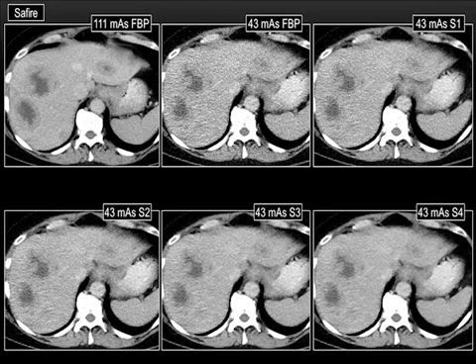So this is something which radiologists are looking for, now that they are well trained. They see that the IR is reducing noise, but they're very picky, or very particular, about the visibility of small structures or lesion margins. And this affects the visibility of the lesions too.